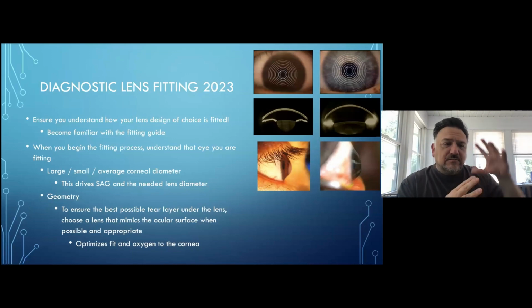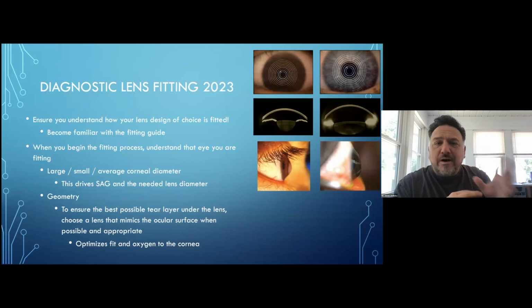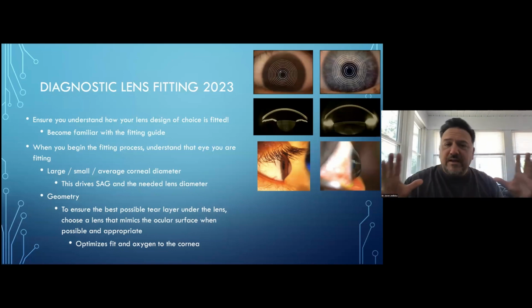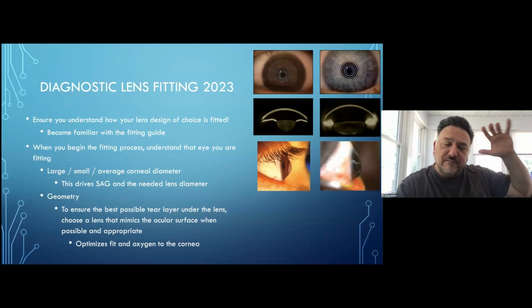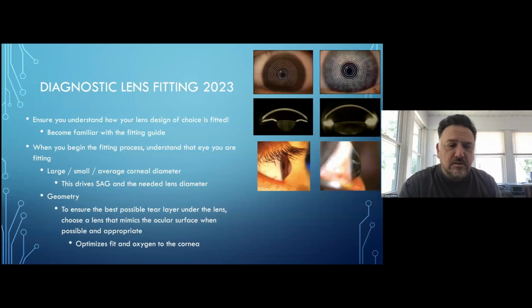At the end of the day, though, I don't want excessive or inadequate clearances over any more of that lens than I have to have. So if I have a patient who's got a steep cone, I want a fairly steep base curve lens. I still want to somewhat mimic the shape of that eye, because if I don't, I'm either going to end up with too little central clearance or too much clearance in the mid periphery, which is going to affect the fit and the health of the cornea underneath it. So I still think it's important to relatively match the shape of our lens to the shape of the cornea we're fitting when possible.